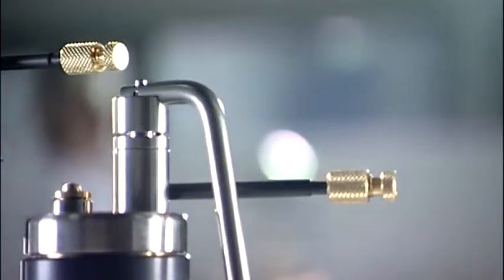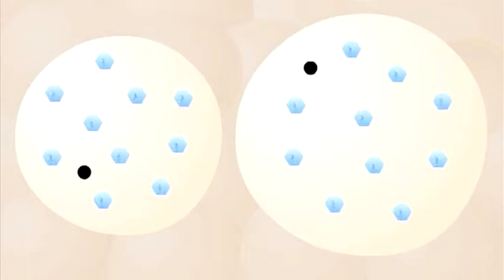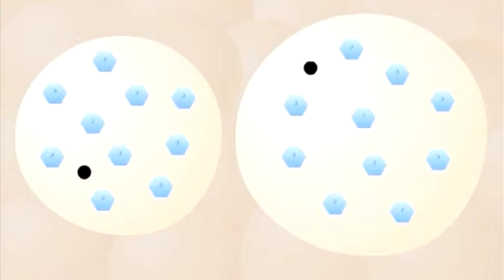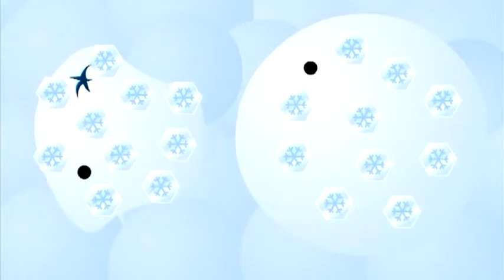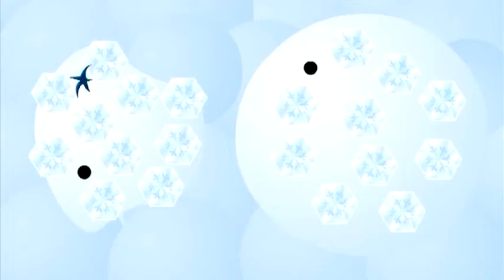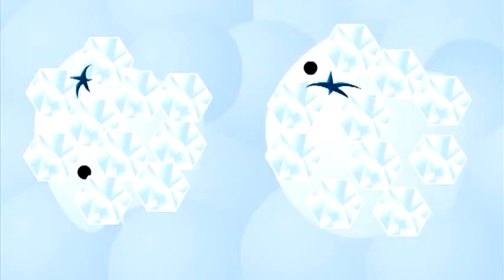Cryosurgery is the deliberate and controlled destruction of diseased tissue by cold. As tissue is rapidly supercooled, intracellular ice formation occurs, leading to rupture of the cell membranes and consequently cell destruction. As you know, water expands during freezing. Similarly, recrystallization by slow thaw is responsible for even further tissue destruction. Accordingly, quick freeze, slow thaw is the mantra of cryosurgery.